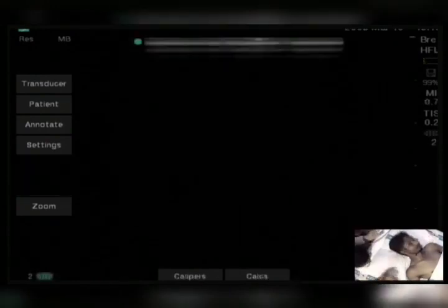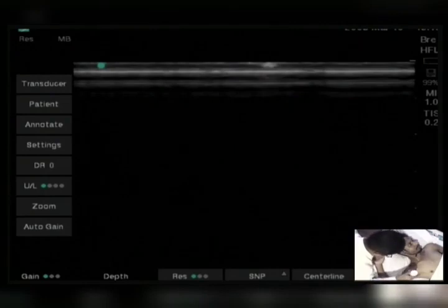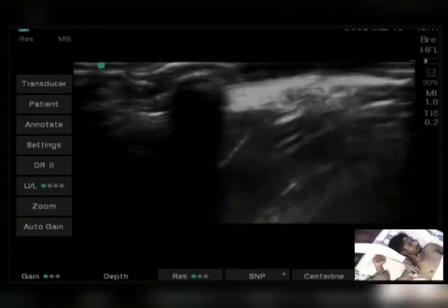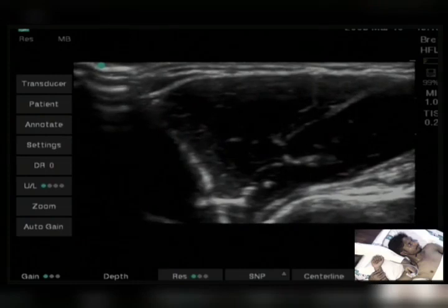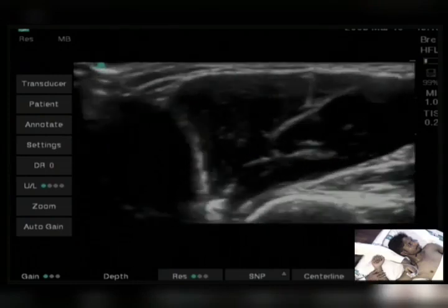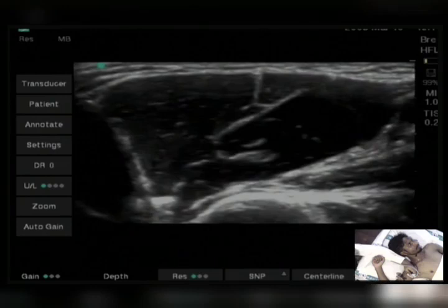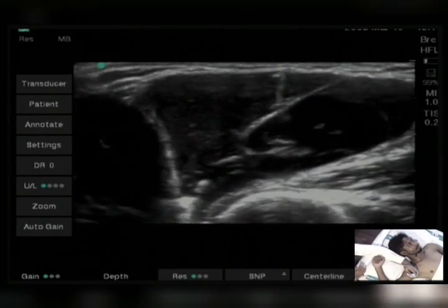Now I am going for the axillary. See, there is a 16% variation in the musculocutaneous nerve. But most of the time, very fortunately, I have found it muscular. See, I don't go much into the axilla. I just go a little bit onto the arm area and first try to see the musculocutaneous. Now it lies in between the biceps and coracobrachialis.